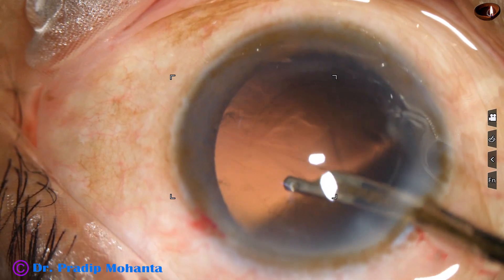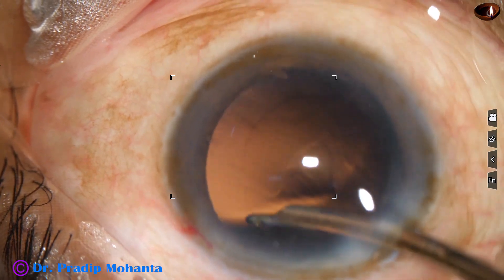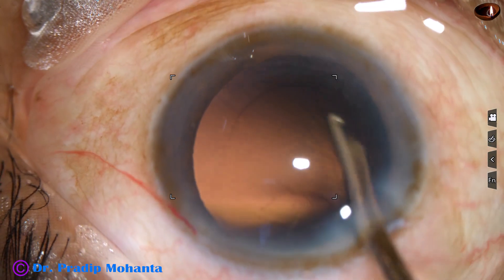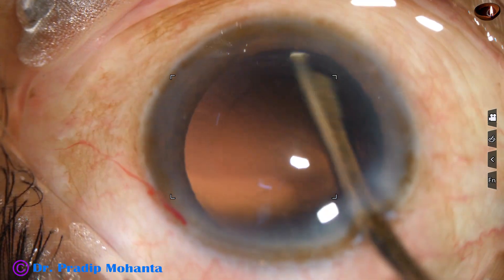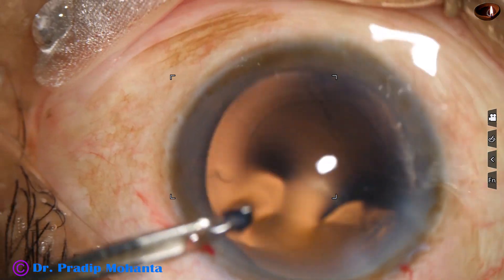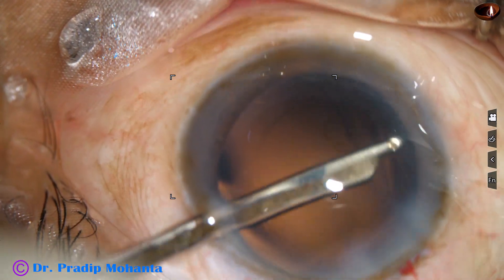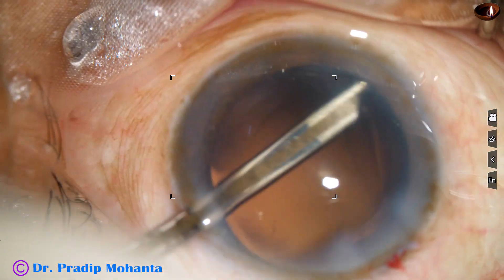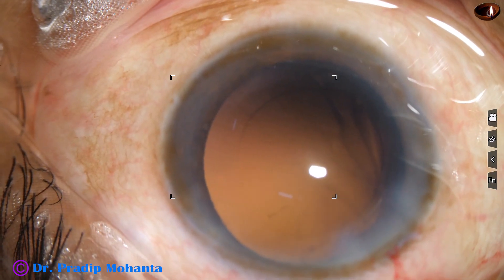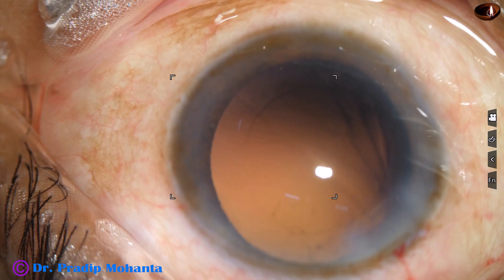The possibility of touching the corneal endothelium by the SIMCO reduces. Going through the side port to remove the cortex from the other side — this is nice cleaning of the cortex.